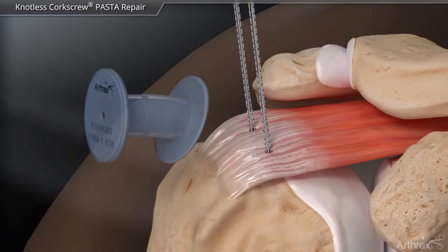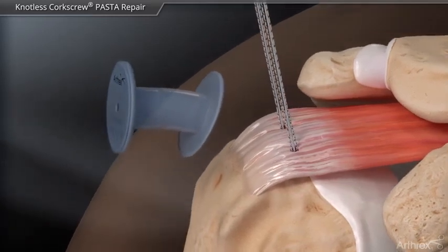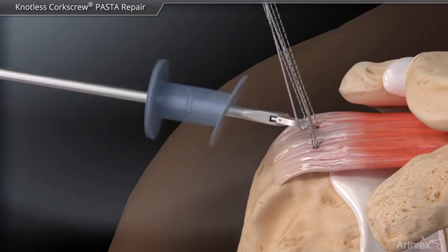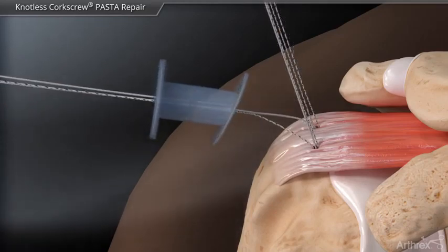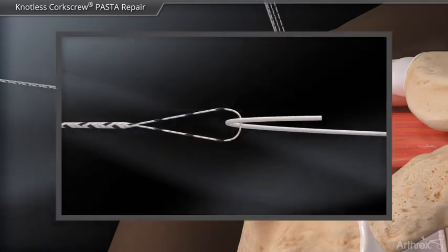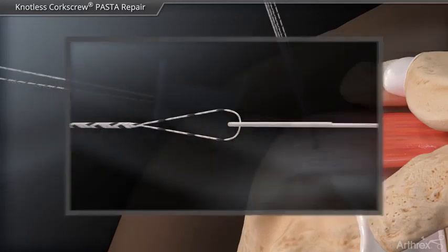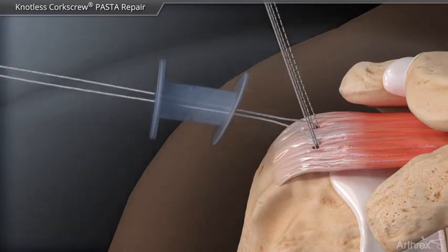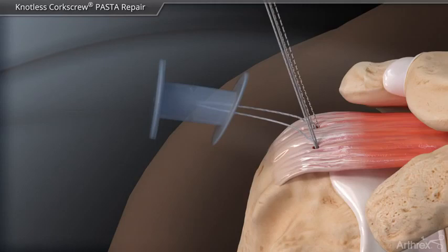In order to create the knotless bridge construct, the repair suture from the posterior anchor and the looped end of the fiber link from the anterior anchor are retrieved out of the lateral portal. The all-white portion of repair suture is loaded into the loop and shuttled back into the anchor locking mechanism. The suture is then pulled down to the rotator cuff but not tensioned.